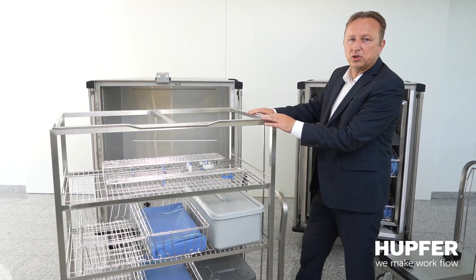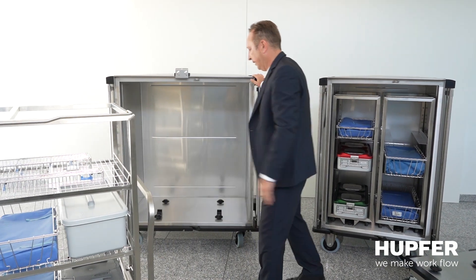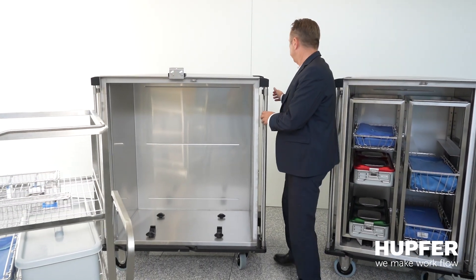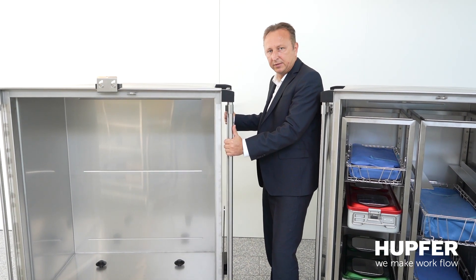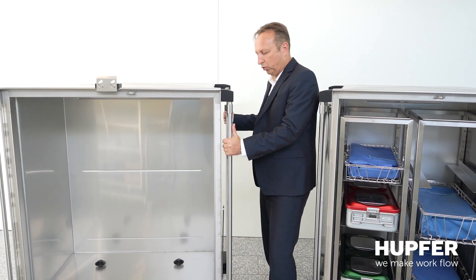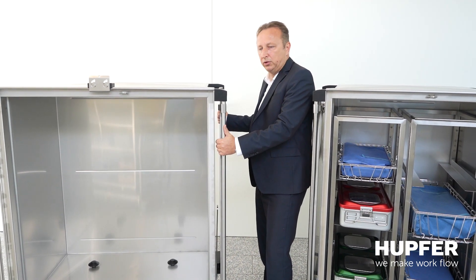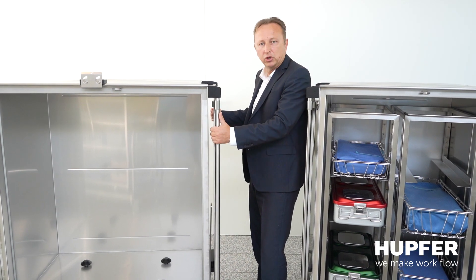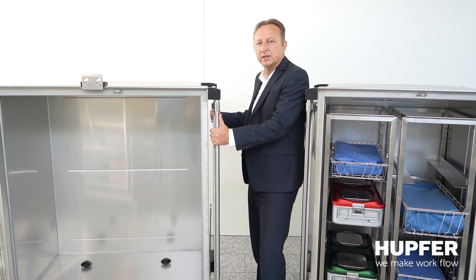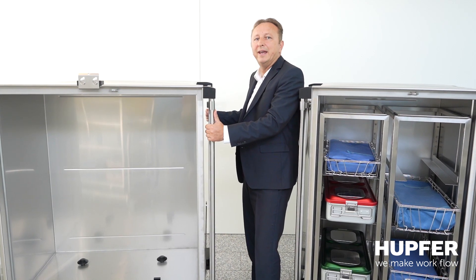Another question is how do you transport the closed cart — is it manually transported? We have vertical handles which you can use for pushing the trolley even when the door is open. You can also set up a train system using a coupling and shaft system integrated into the cart, or adapt it to an AGV system.